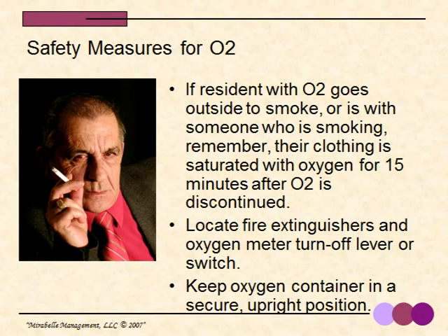If a resident with oxygen goes outside to smoke or is with someone who is smoking, remember their clothing is saturated with oxygen for 15 minutes after their oxygen is discontinued. It's a good safety precaution to locate fire extinguishers and oxygen meter turn-off lever or switch. Be sure that you keep the oxygen container in a secure, upright position.